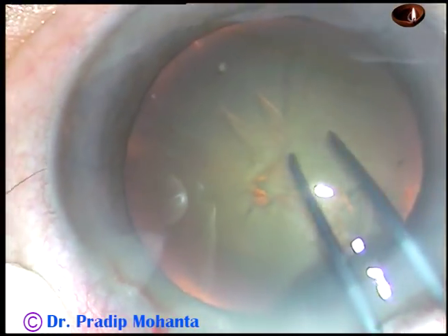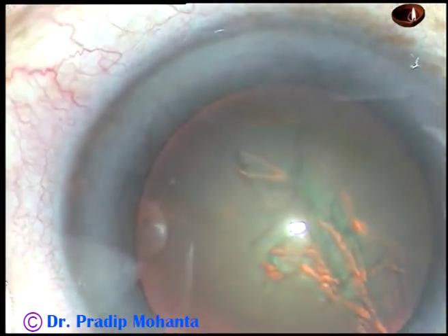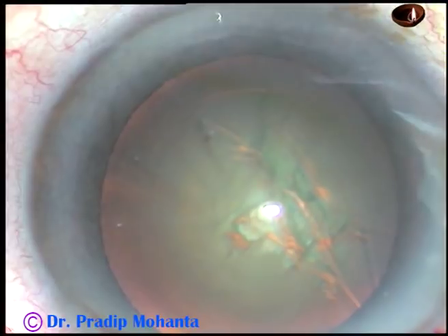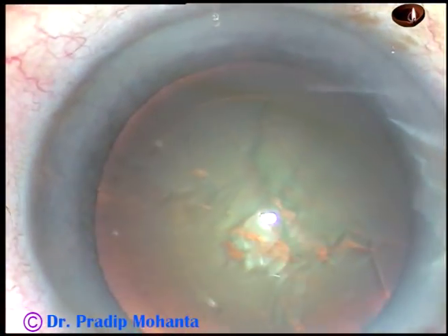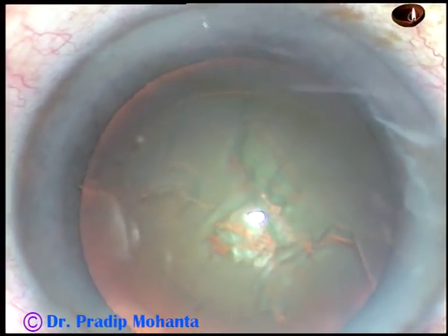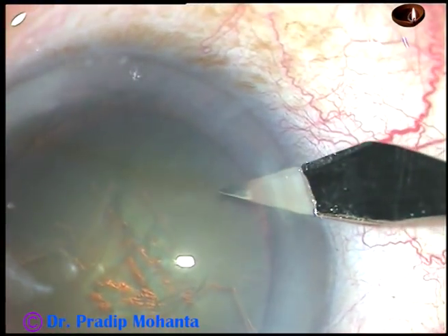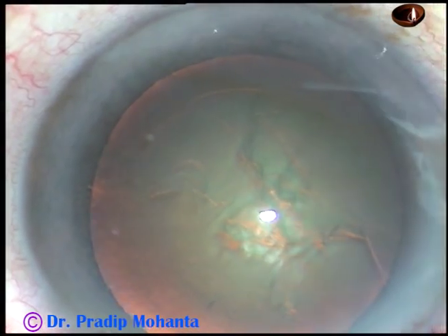But as I go towards 6 o'clock, I find that the anterior chamber is very shallow and the utrata is almost touching the cornea. So I came out, injected some more viscoelastic substance, and asked for the knife again. I am making a very small paracentesis at around 8:45 o'clock.